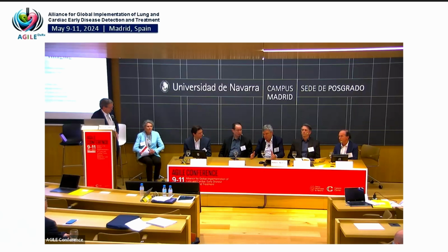But at the same time, AI also comes in. So you do the automated AI on the reconstruction of the calcium score, and then you think automatically that the heart rhythm will be the spoiler. But then you find that the AI did not do the right anatomical identification, and that is probably more the reason than the acquisition. So that all has to be figured out. Yes, so these are complex issues.